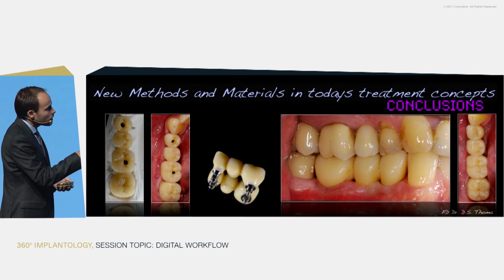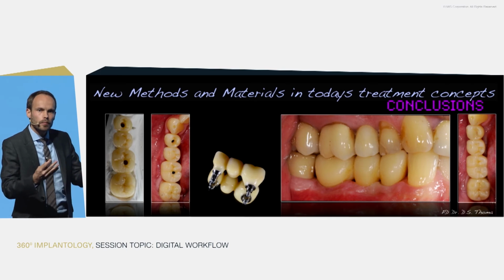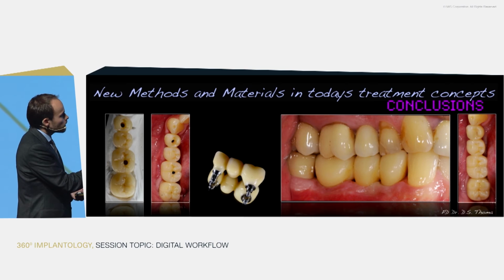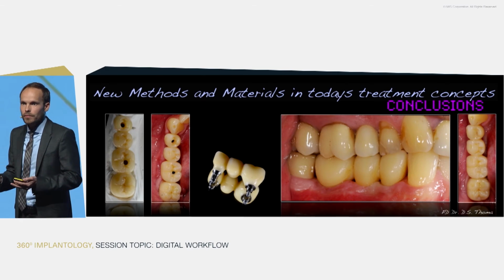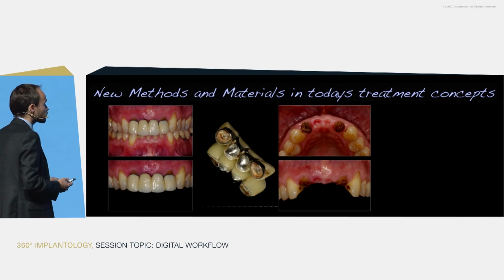And yes, we add a little bit of ceramic here and there if we think that it might add up nicely to have a better contour or a better fit. But in the worst case scenario, there will be a minor chipping, yes, but it will be so minor that the patient will hardly see it or feel it.